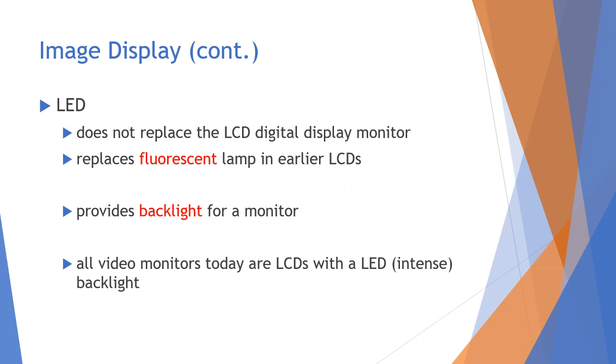The LED does not replace the LCD digital display monitor. What it does is replace the fluorescent lamp used in earlier LCDs and former monitors. It provides a backlight for a monitor. All video monitors today are LCDs with an LED backlight, which is an intense backlight.